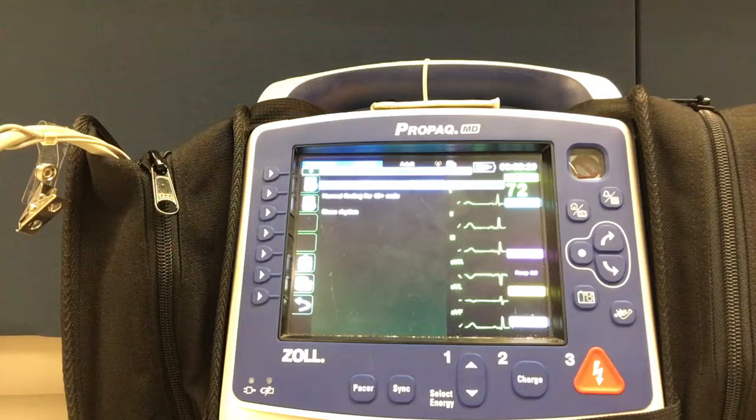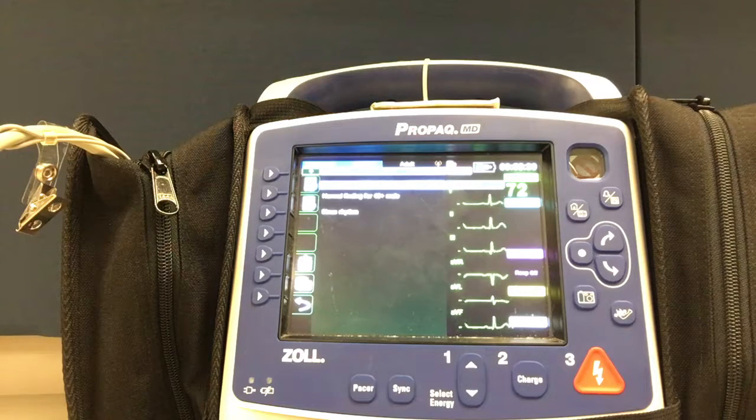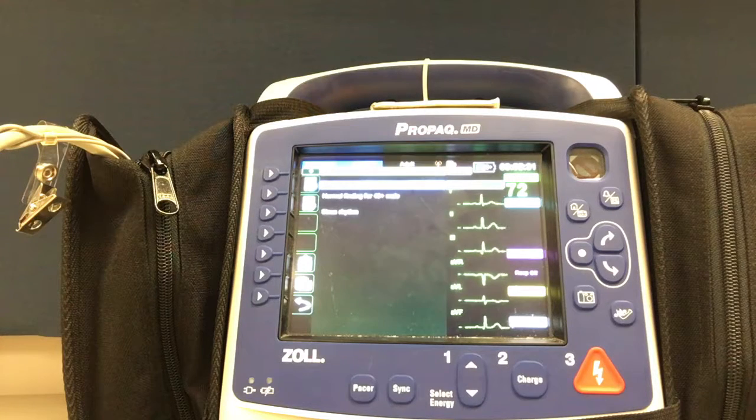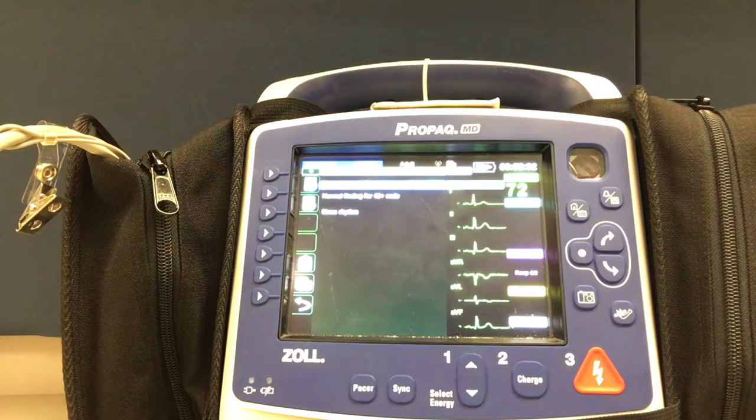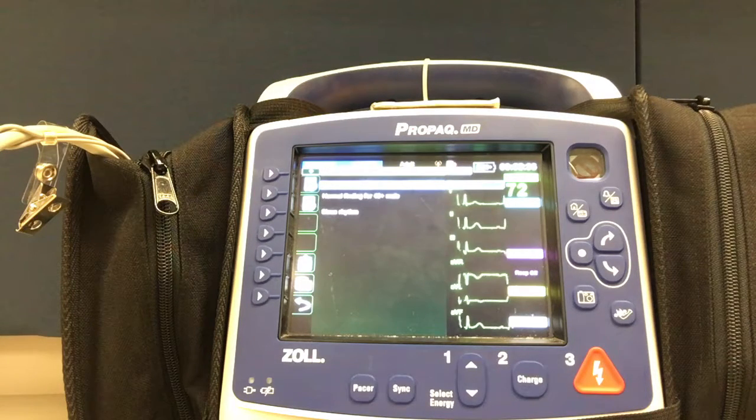This concludes the demonstration on how to obtain a 12-lead EKG with the ProPakMD.